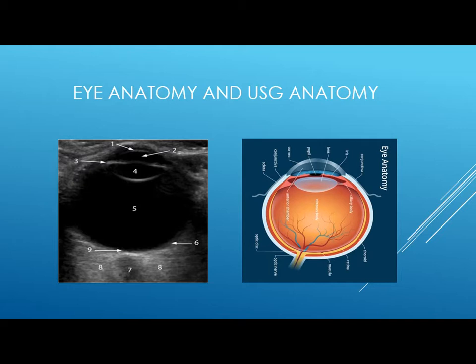Posteriorly here is the vitreous chamber, which appears anechoic in a healthy adult, and in the elderly you may see some echogenic dots inside the vitreous. The posterior lining of the eye globe here is three layers: the retina, choroid, and sclera. But these cannot be differentiated in normal ultrasound. In the retrobulbar region, we see the optic nerve, which appears hypoechoic radiating from the globe, and here the retrobulbar fascia.